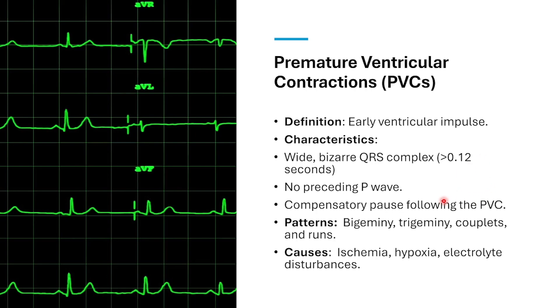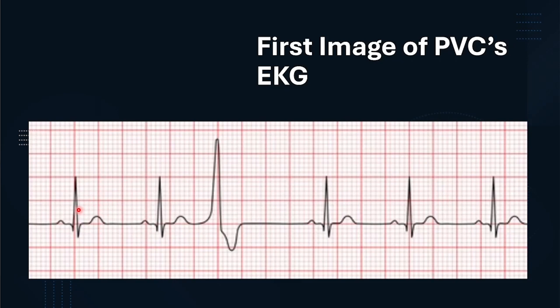Here we can see what's generally a sinus rhythm — these beats generally match up — but we have this weird abnormality where the ventricle contracts prematurely. You can see our P wave, our QRS complex, our T wave, all less than 0.2 seconds, and the QRS is less than 0.12 seconds. But then we have this weird ventricular beat with a QRS way greater than 0.12 seconds — more like 0.28 or even 0.32 seconds. It's a bizarre contraction.